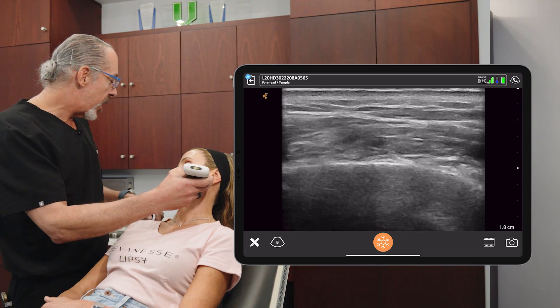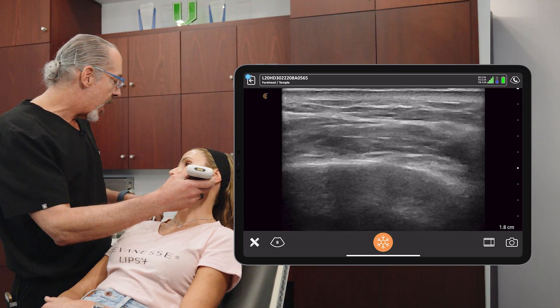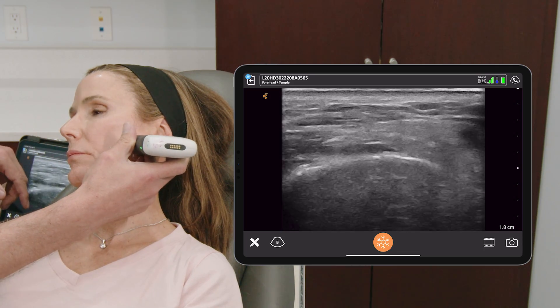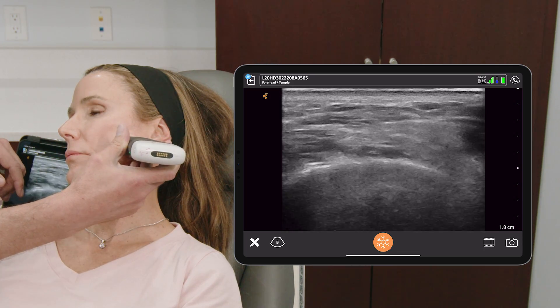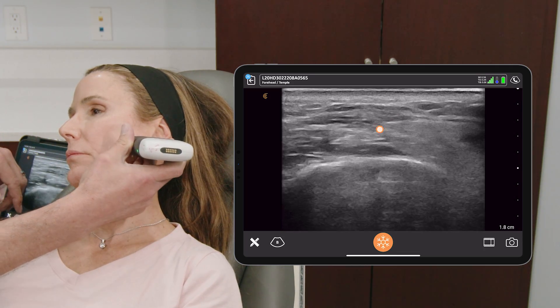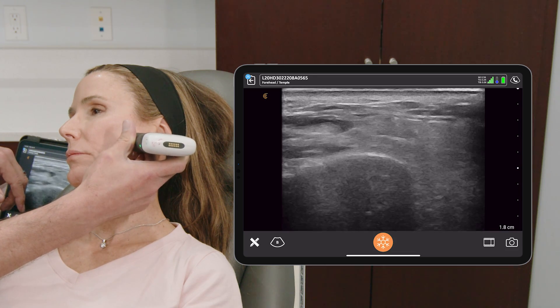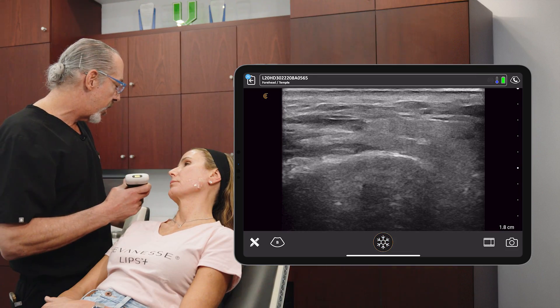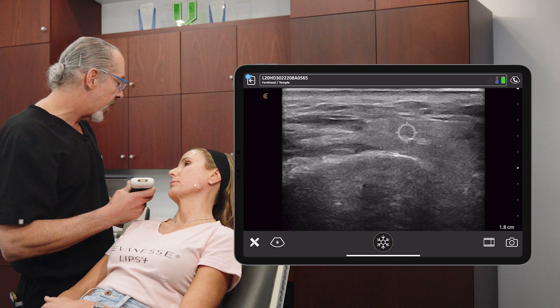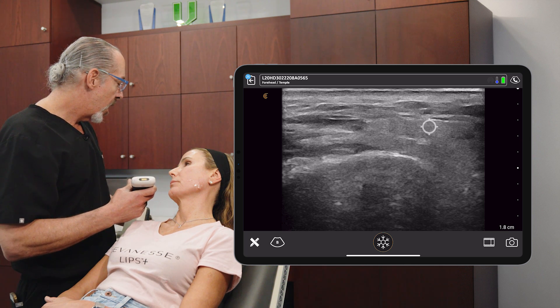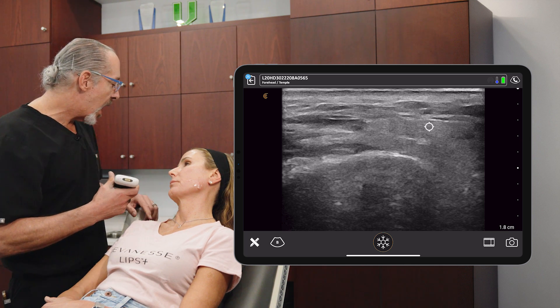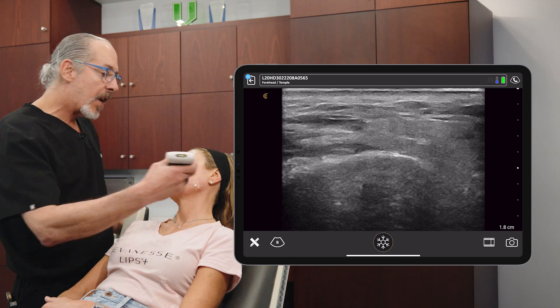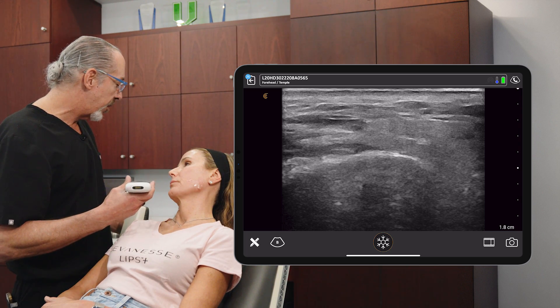We see the masseter lying on the mandible, and if we go a little more posterior we see an isoechoic area which is the parotid. I'll show you the parotid area right in the middle here. This is the parotid, and the parotid lies on the masseter and the posterior aspect of the jawline.